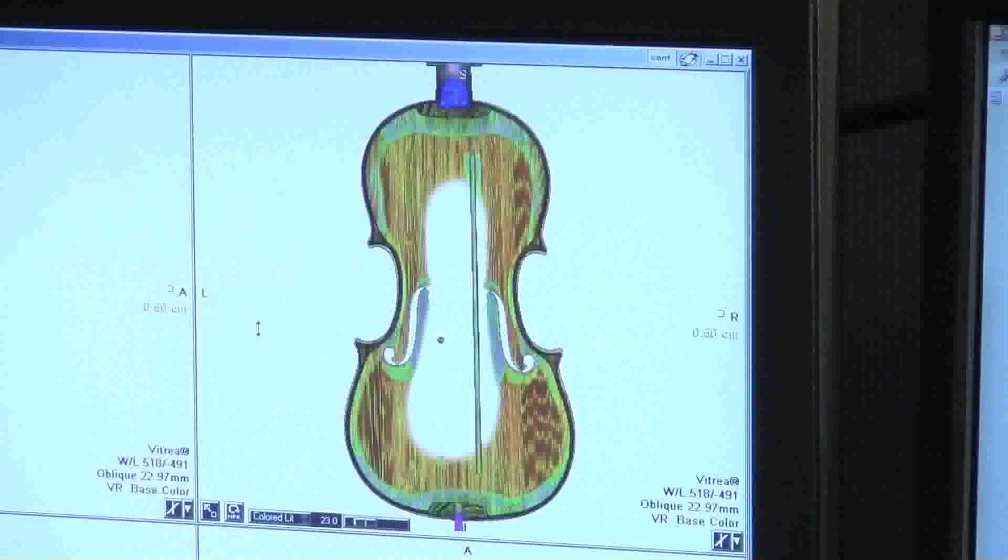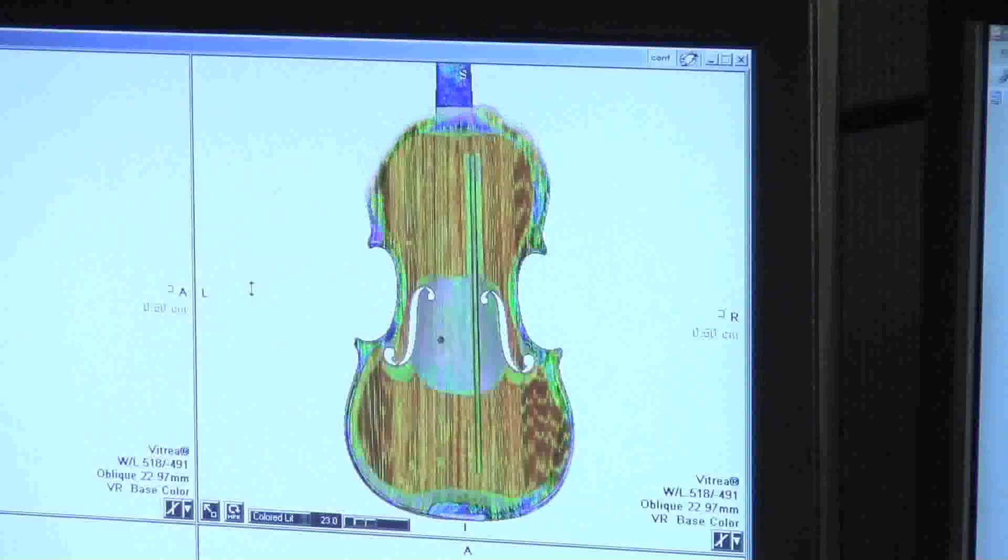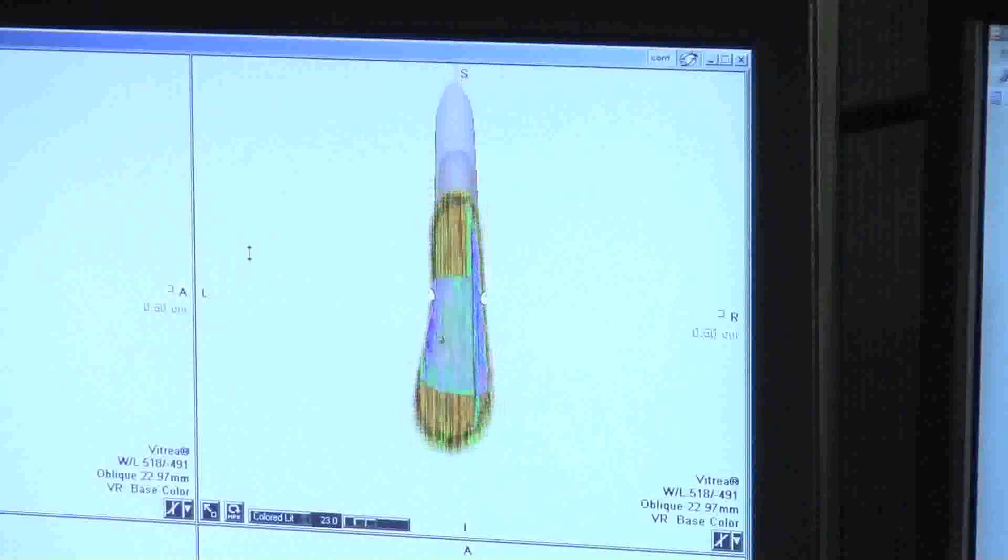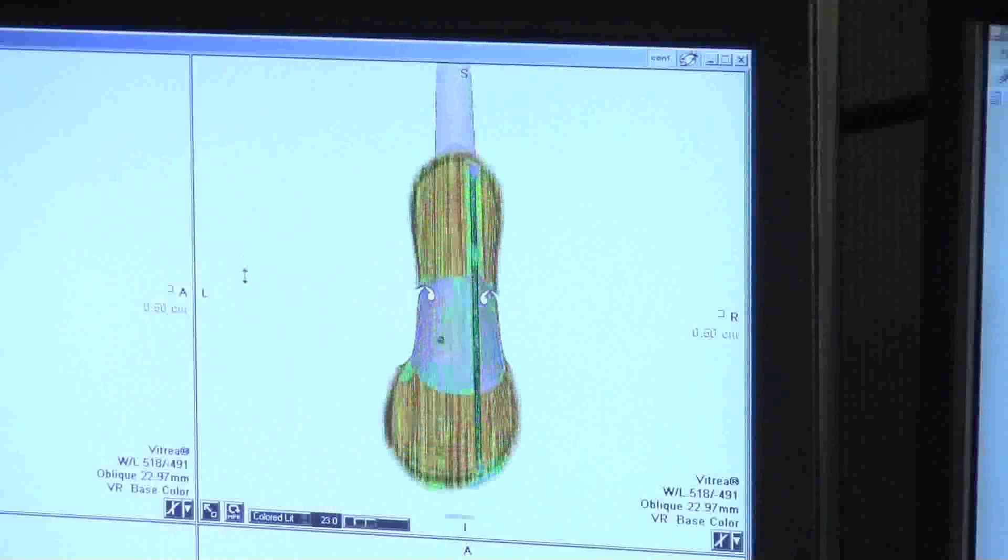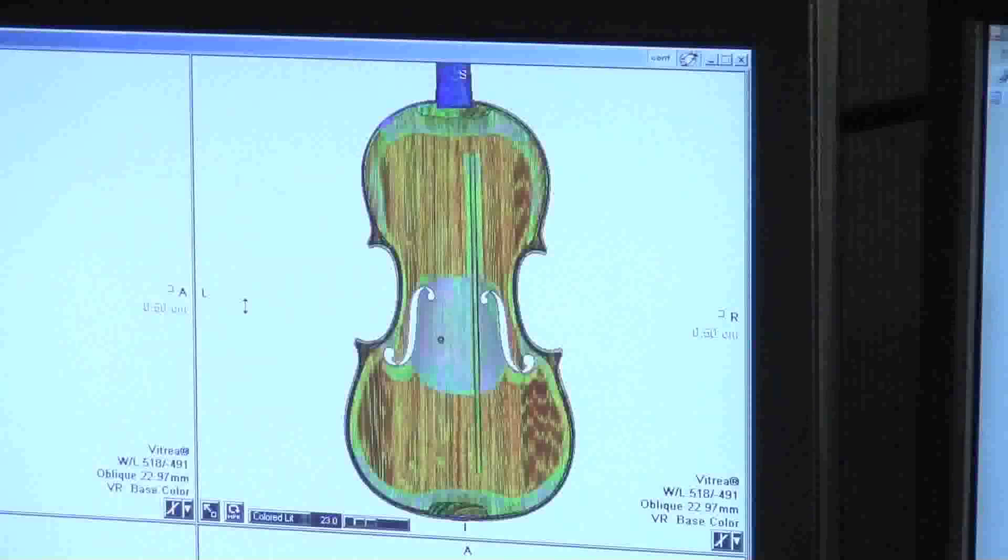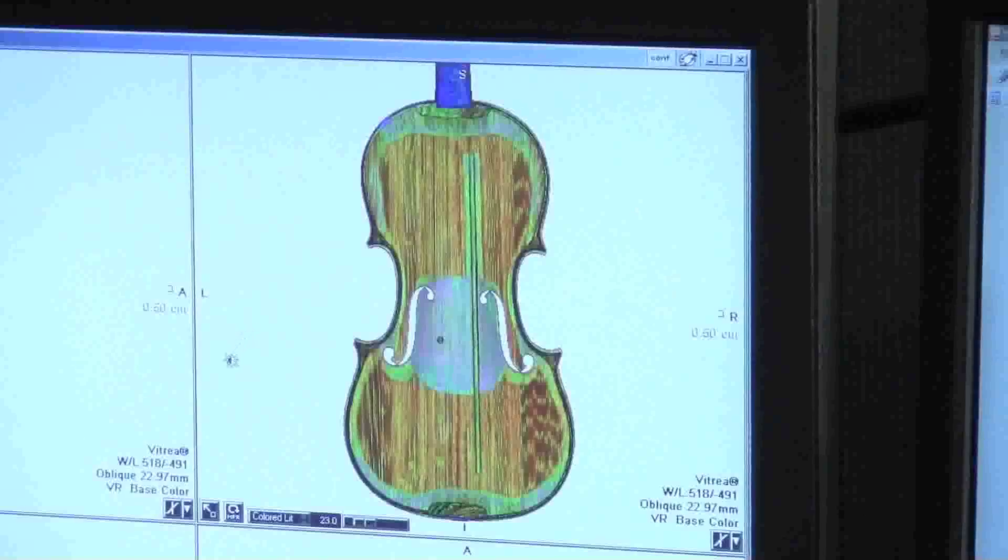And then as we scroll through the data set, we can go through the center of the violin and then look at the inside of the front plate, which these colors are much less dense. The yellows and the reds and the browns are much less dense.